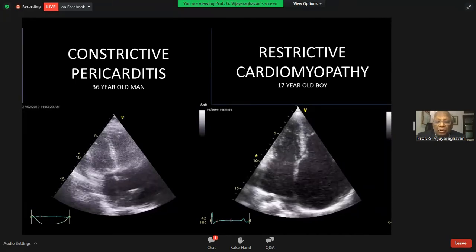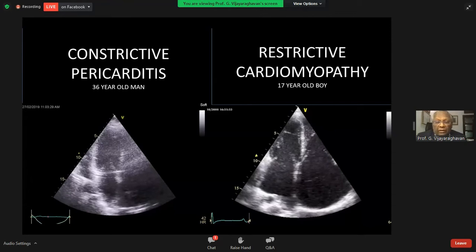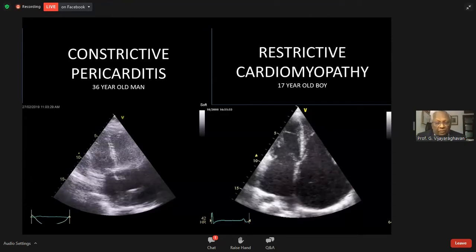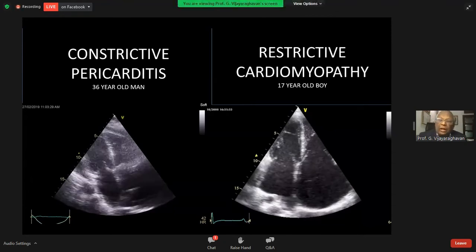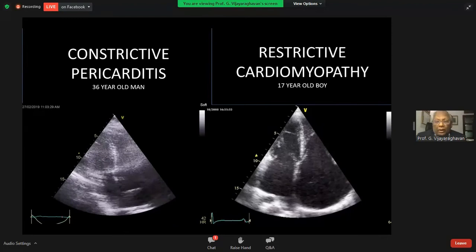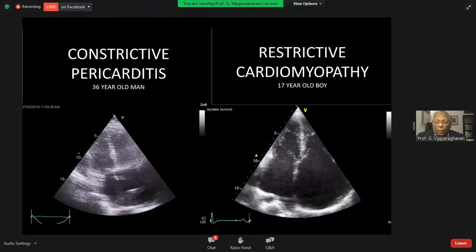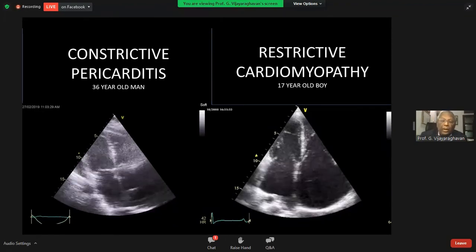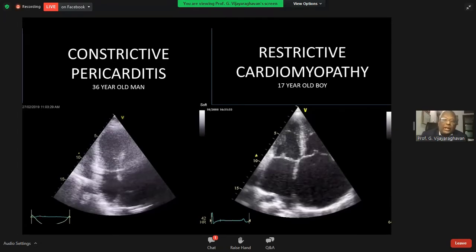There are some things in common, as you can see here. Both the atria are dilated — right and left. Both the ventricles are near normal. It is these similarities which have made all this confusion between constrictive pericarditis and restrictive cardiomyopathy.